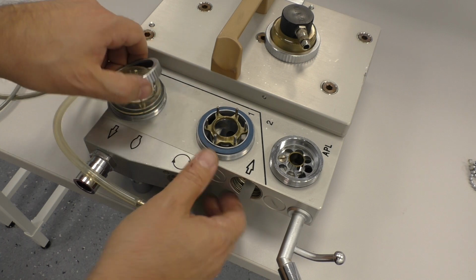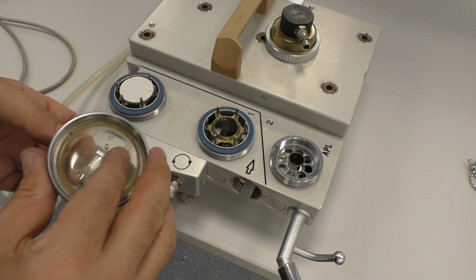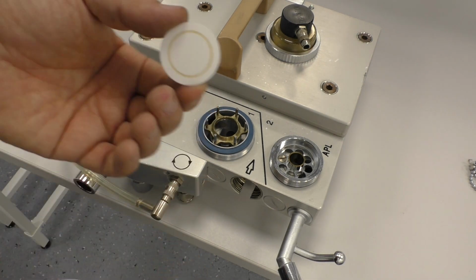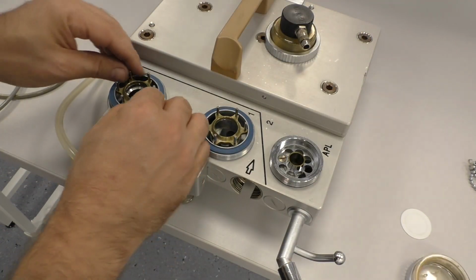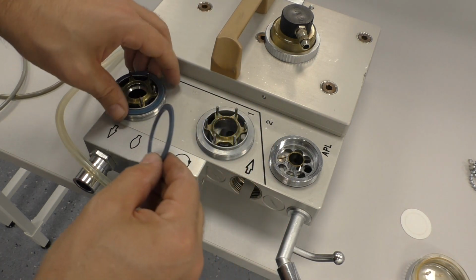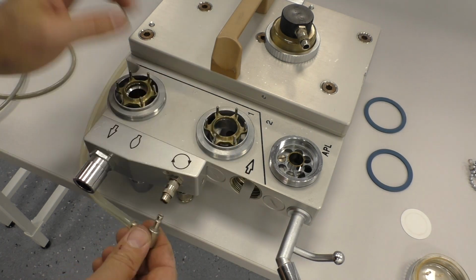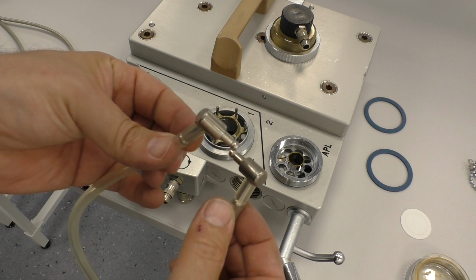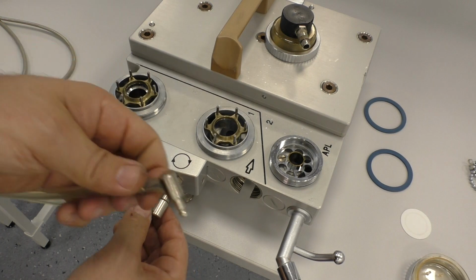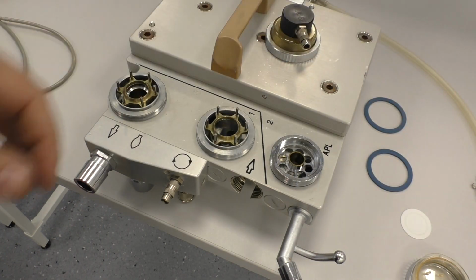There is a second valve. It just has a cover here, some restrictors. It's another disc. It's the same as the one before. It's the same kind of valve. Can we move that? No. We also have a blue gasket here. Gasketeer. It's not a musketeer. Then quick release hose connections. Very nice. Very good for example, for an airbrush gun. I think I will keep that too.